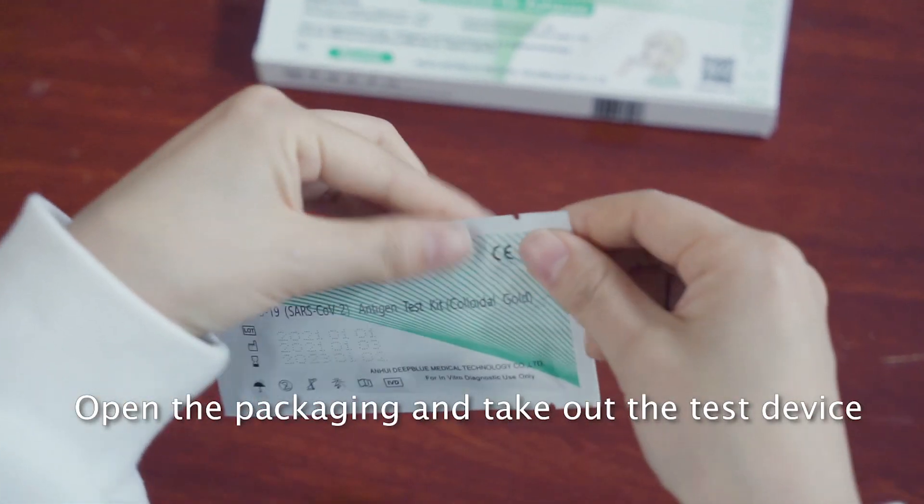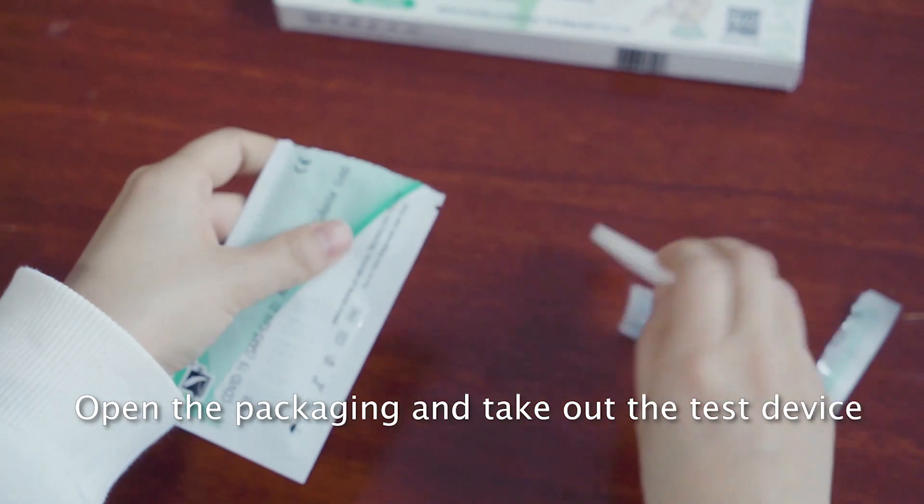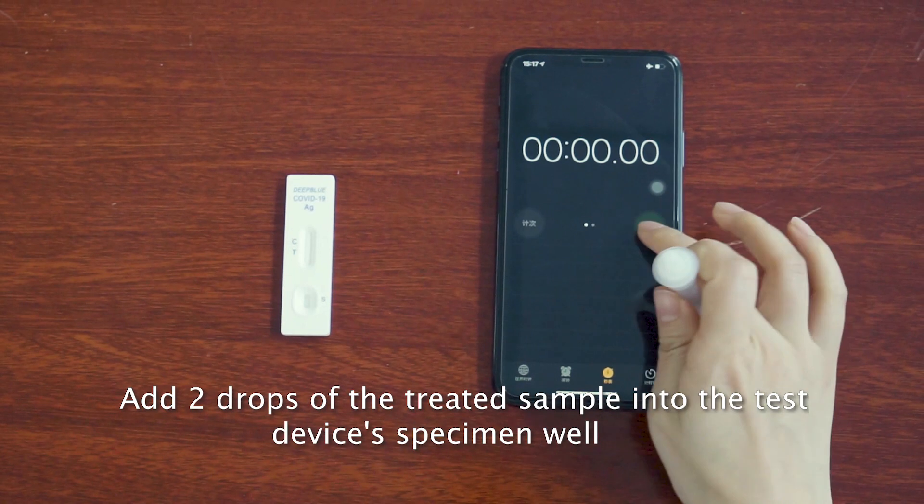Open the packaging and take out the test device. Add 2 drops of the treated sample into the test device's specimen well.